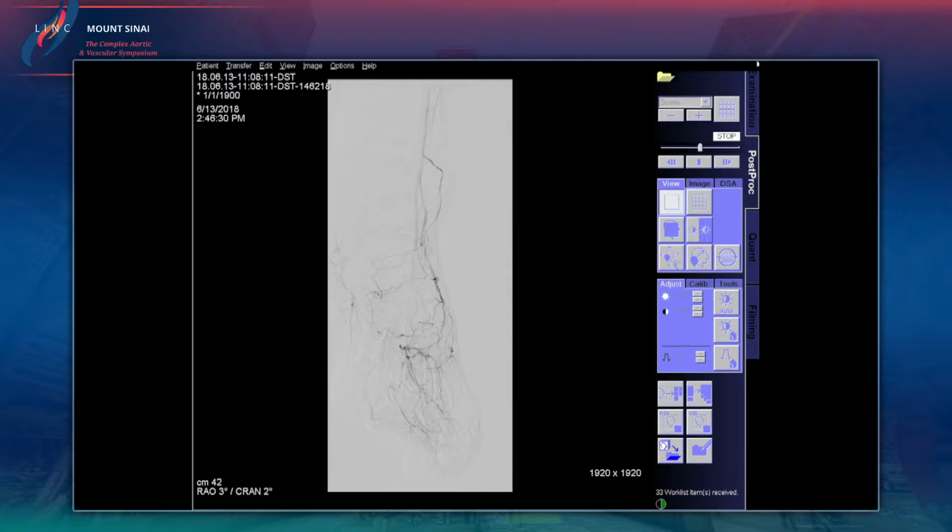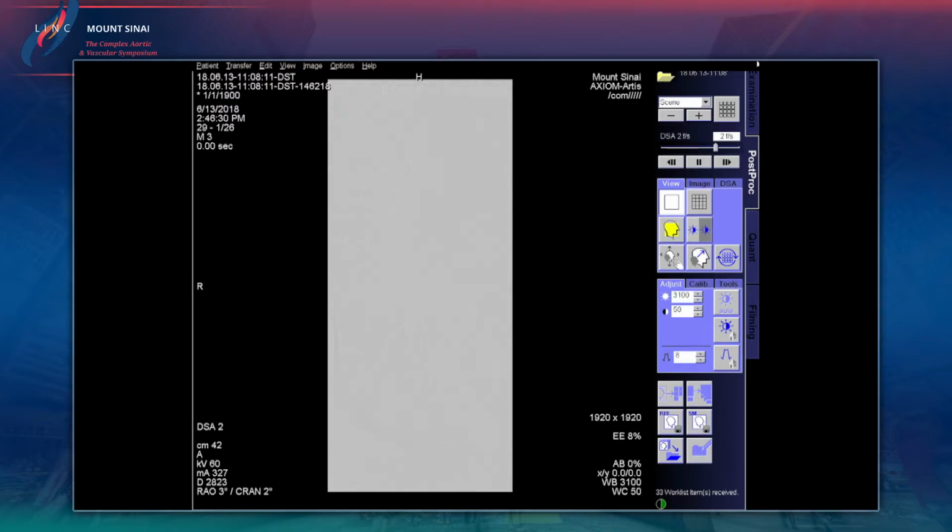See, you can see that's the problem with that area where he's got the wound. The issue is going to be whether opening just this up is going to get enough flow down there to heal this. The question is also whether once we open this up, the pressure head will increase and allow us to get a better visualization to see whether we can form the arch as well.